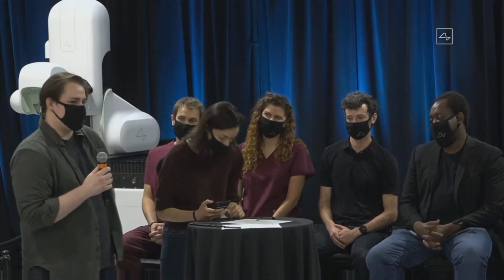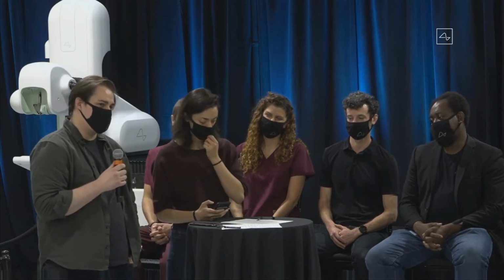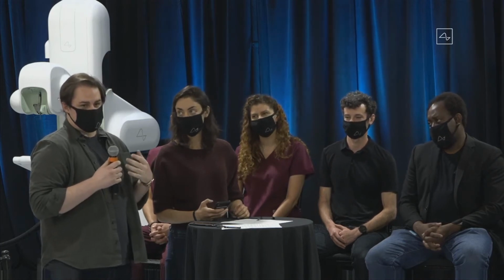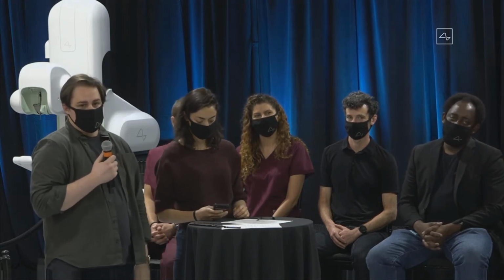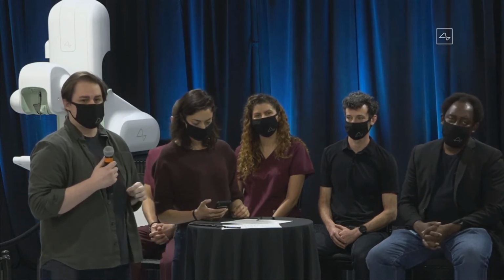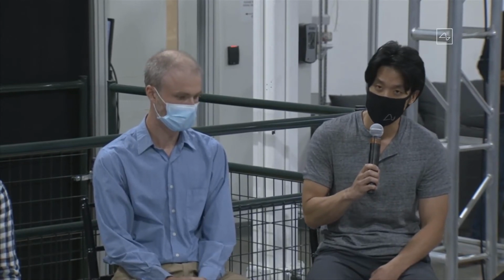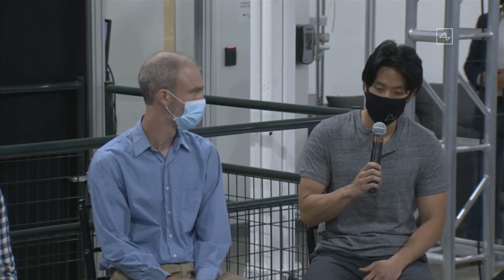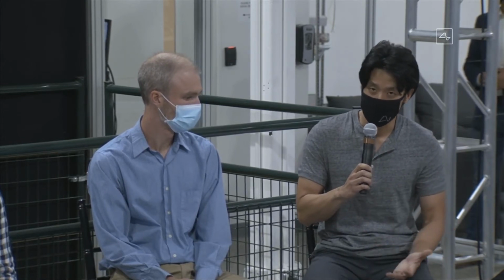Yeah, so there's a lot of Twitter comments coming in about a question that I think is on everyone's mind, no pun intended. What does the security of the device look like? What kind of precautions are being taken, and what does the future look like for the security of the system? So first and foremost, privacy and security are top priorities at Neuralink, especially given the sensitivity of the data we're collecting. One of the things we're ensuring is that a lot of the interactions with the brain data are encrypted and authenticated properly.